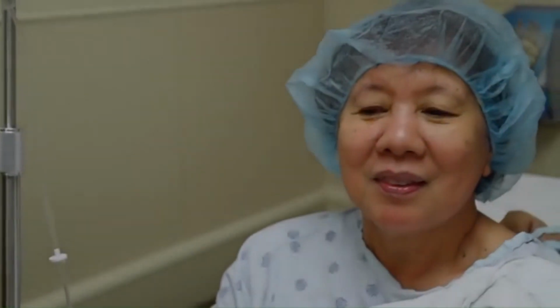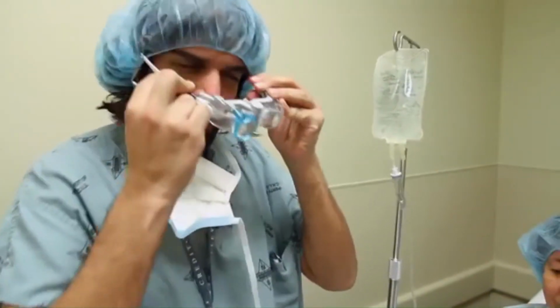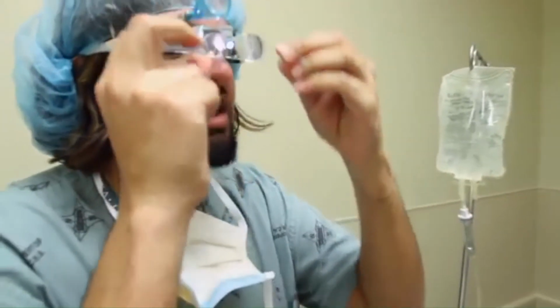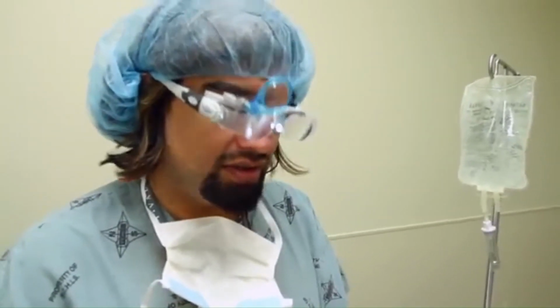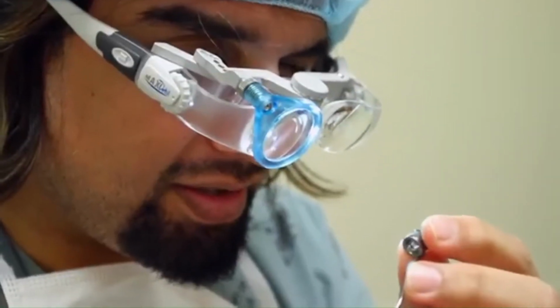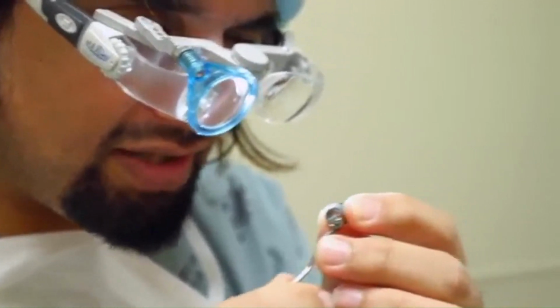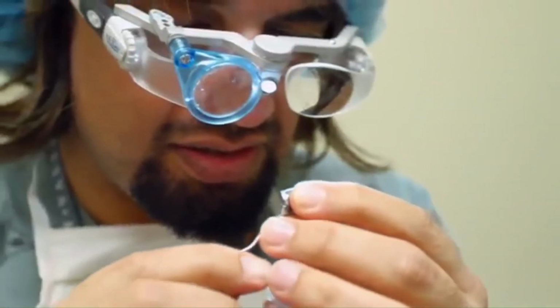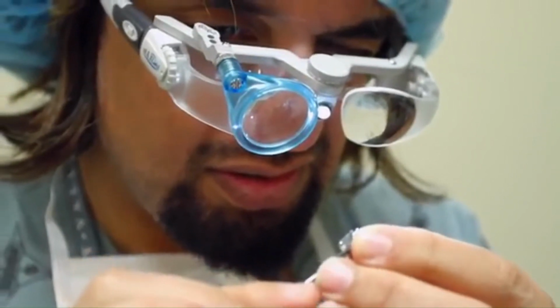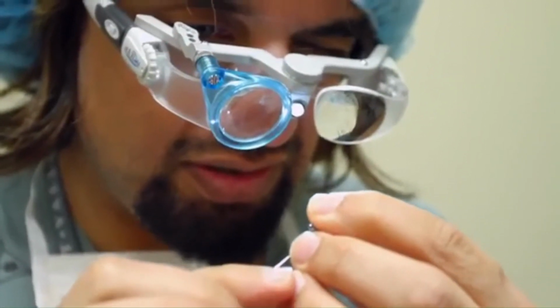Okay, so I'm going to be showing how I put these glasses on. These glasses provide a point of fixation and some magnification. Now this little magnifier here allows me to look at the one-step marker and set the axis on the marker by looking through this magnifier here.